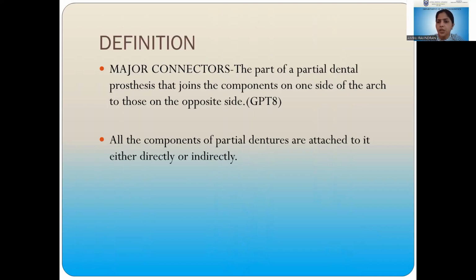Coming to the definition, it is that part of the removable partial denture that connects the components of one side to those of the opposite side. So all the components are connected to the major connector directly or indirectly.